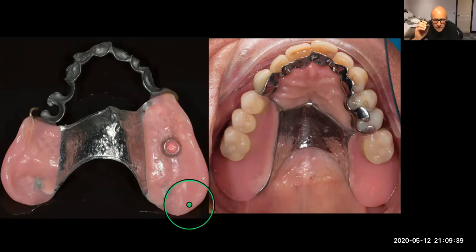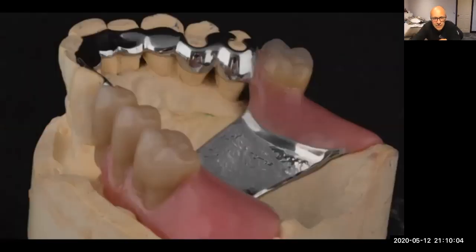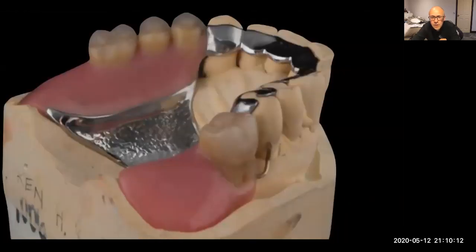We've got full extension around the tuberosities. We've got great tooth support all the way around here and full extension around the back. The lovely thing about having an implant there is there's no clasp on here, which is great. And this clasp here, we've kept it tucked away. So that's that clasp there on that back tooth. So the aesthetics are going to be really, really good. Again, he's periodontally prone, this chap. Keep it away from the gingival margins. That's our clasp on the other side.